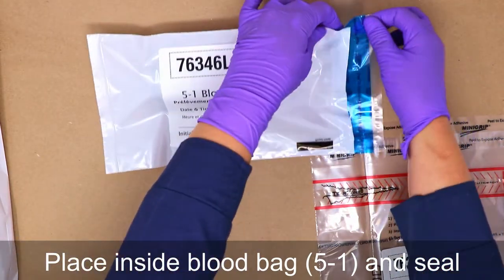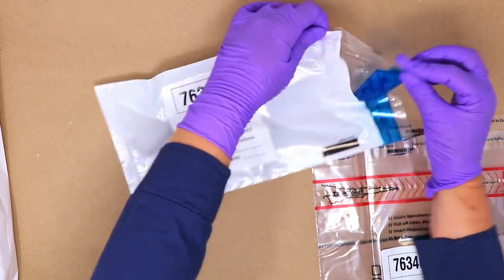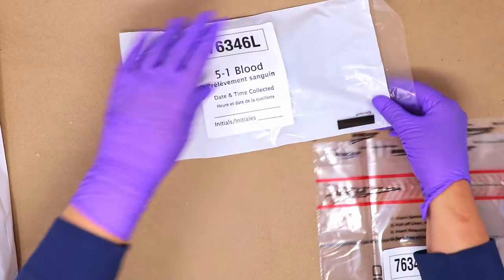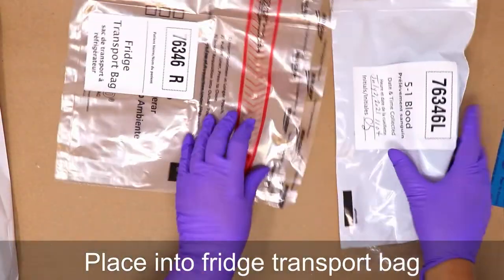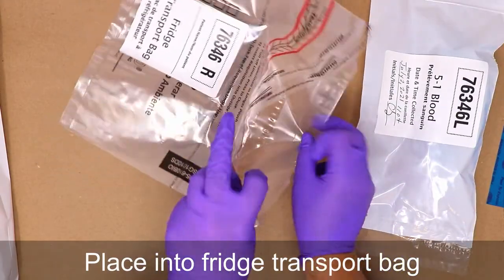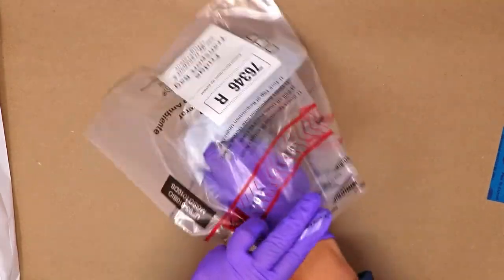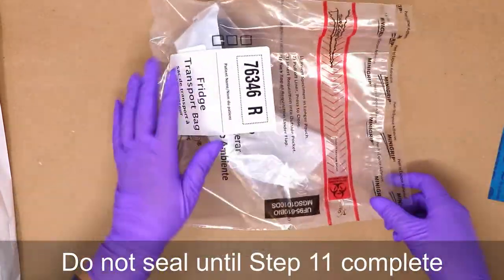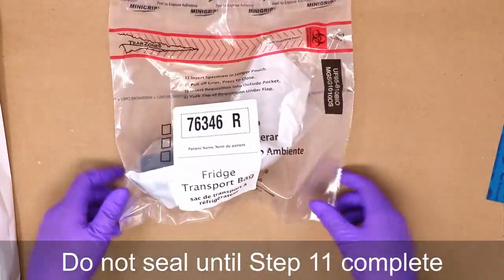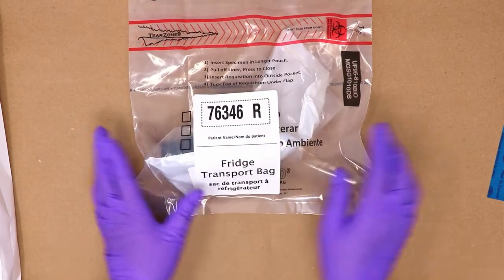This blood bag can then be sealed and placed inside the fridge transport bag. Please note that the fridge transport bag will also be used to contain urine that's collected in a later step. As such, this bag should not be sealed until step 11 is complete. Patient's name can then be added to the outside label. The paperwork can then be completed.